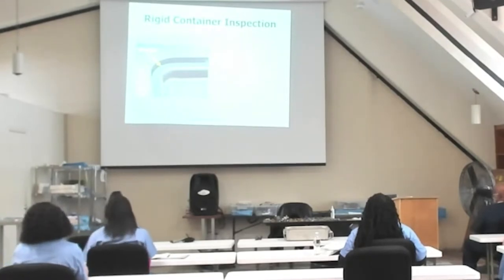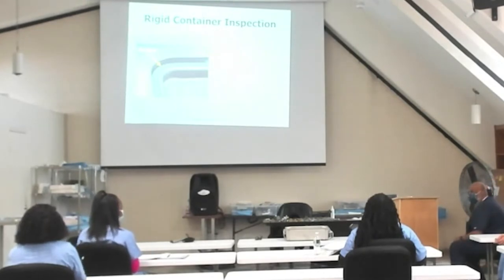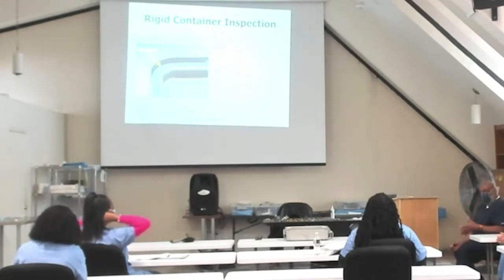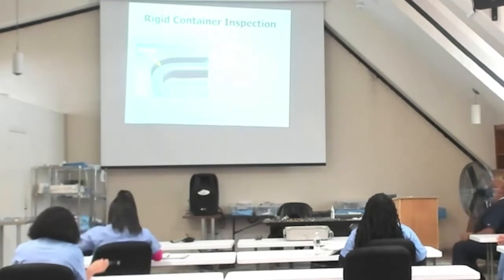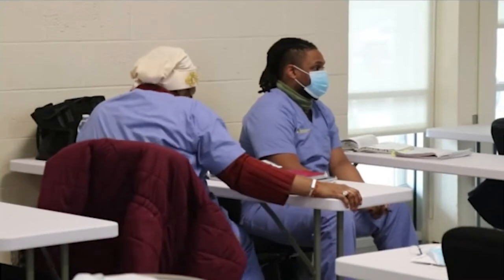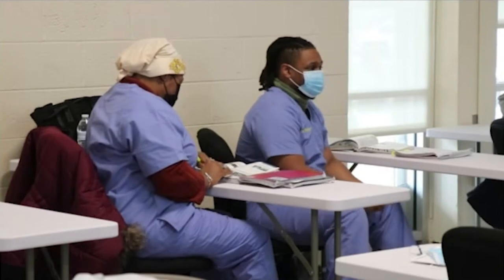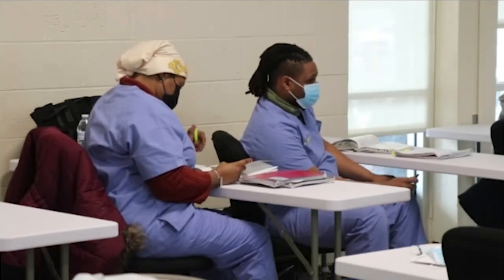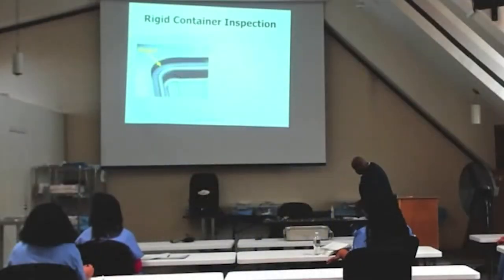You're manually cleaning instruments. Do you manually clean everything? All right, do you push everything through the mechanical washer? Why? How do I know if it's manual or mechanical? IFUs, good. Now, gaskets, you're going to become familiar with this term because gaskets are kind of like insulators, okay?